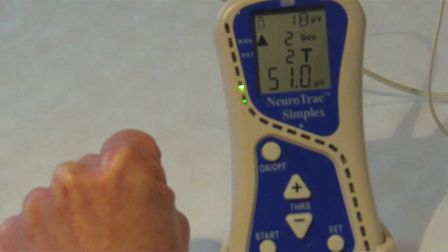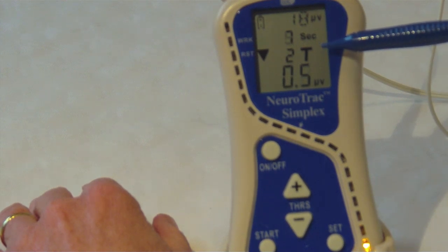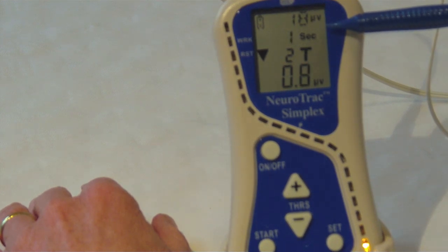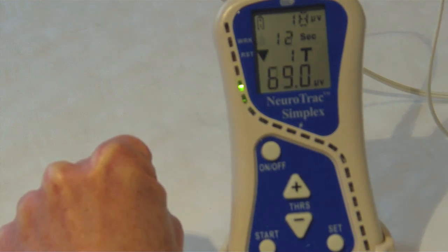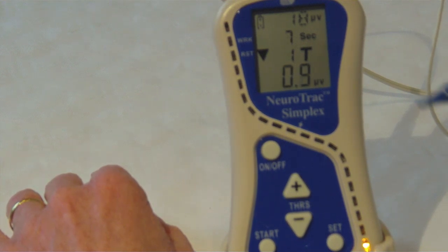I'm working my muscle to its maximum and then resting it completely. You can see the number of trials — I've set it for four and I've just got two trials left. Relaxation, full contraction for six seconds, good hold, hang on, and then relax again. Let that muscle completely go. And that's the trial finished.